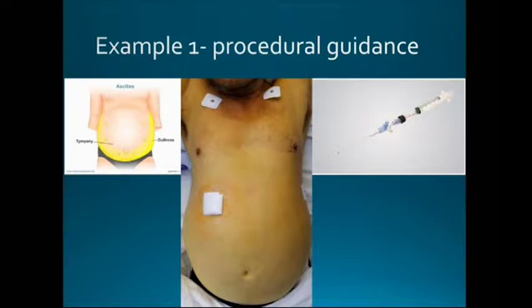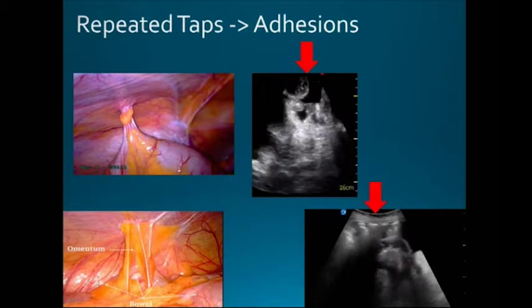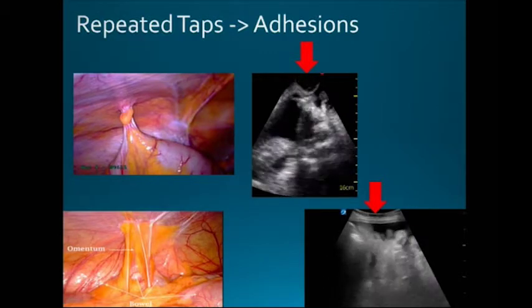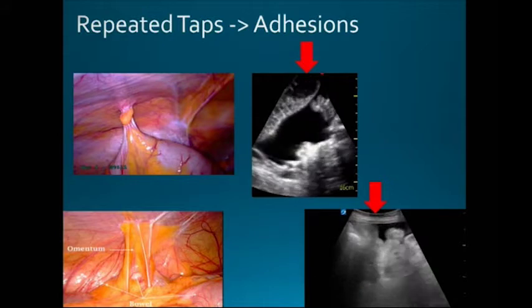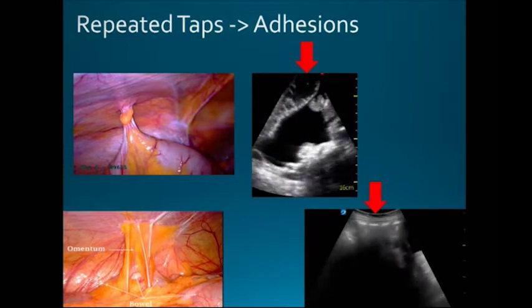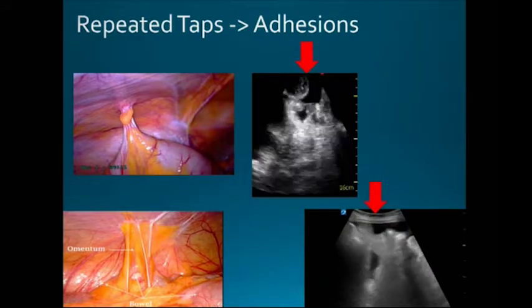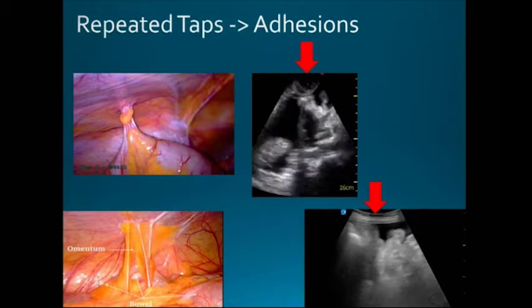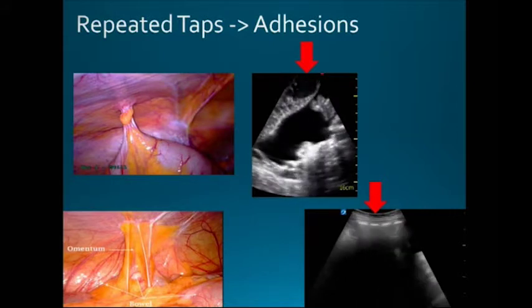But the problem with repeated taps is that over time you develop adhesions to the abdominal wall, and sometimes the bowel will loop up against the abdominal wall. In this particular patient, they went to the ER and got a tap. We can't tell in hindsight whether or not they used ultrasound, but it doesn't seem so based on the procedure note. Then he represented 24 hours later, septic, hypotensive, very, very sick, and he had a bowel perforation, presumably a complication from his paracentesis. And this is an ultrasound image from one of my residents who was preparing to do a paracentesis, and they were going to put in the needle right at this particular spot.